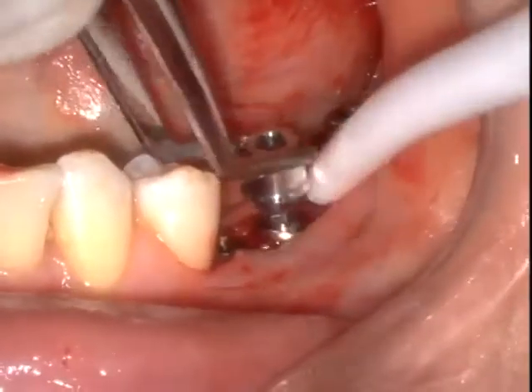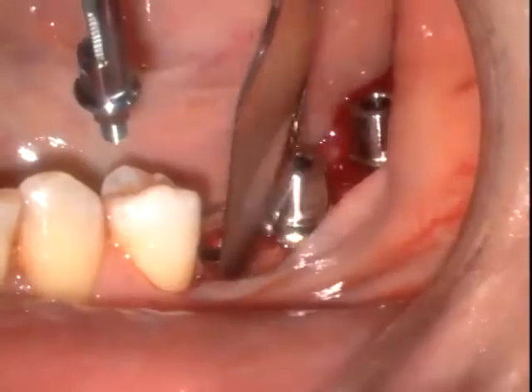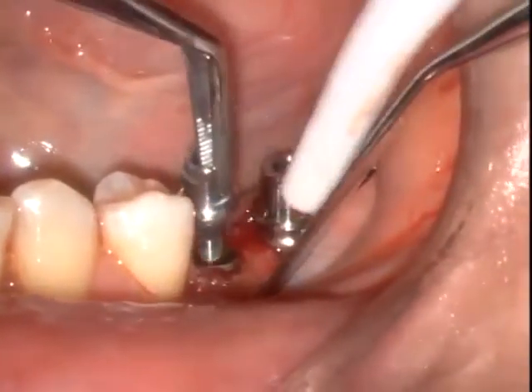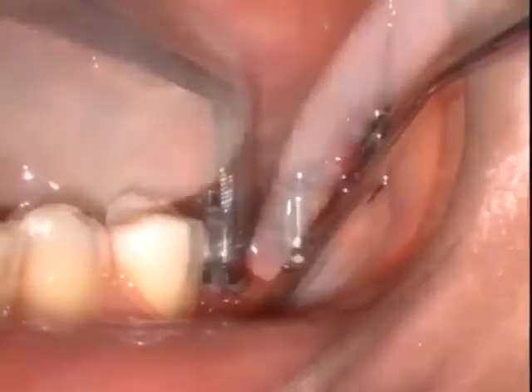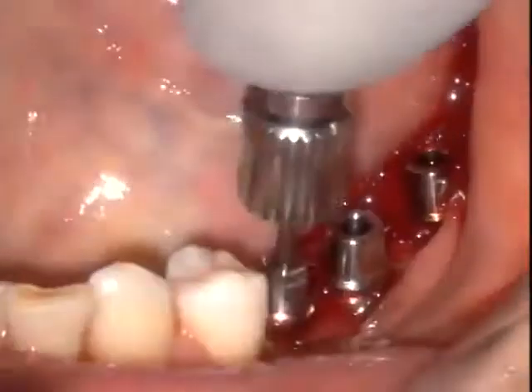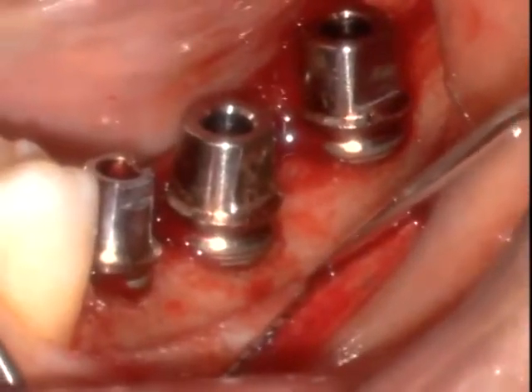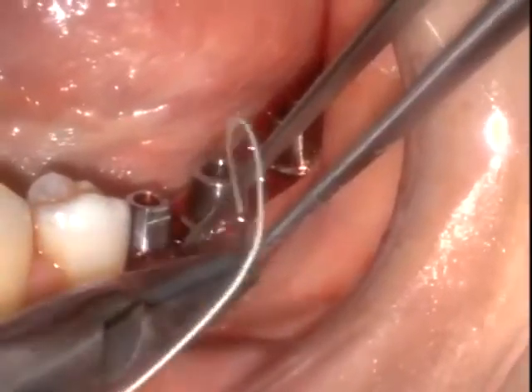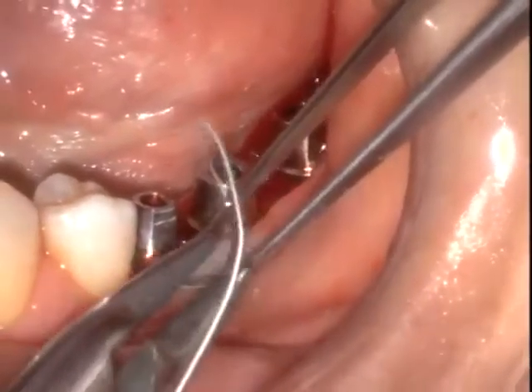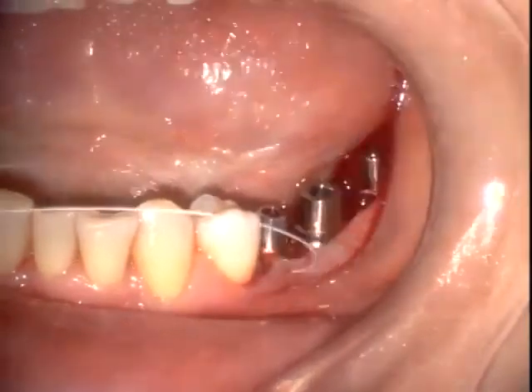You can see the flat sides are placed towards the buccal with the internal hex, which has been coordinated to fit towards the facial aspect, so the final abutments can be selected in the process that we've termed one abutment, one time, something my brother and I had talked about and developed years ago. The concept of being able to place abutments so they never have to be removed as part of the future restorative procedures, leaving us with a tight connection and preserves the crestal bone.